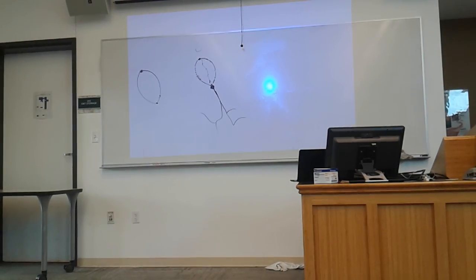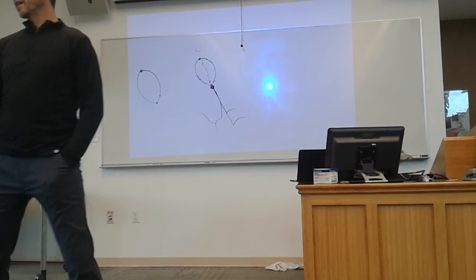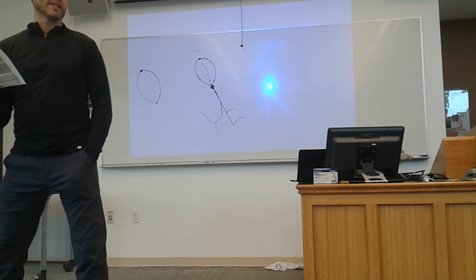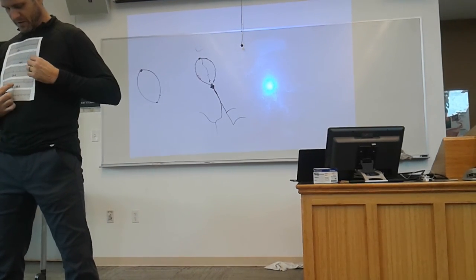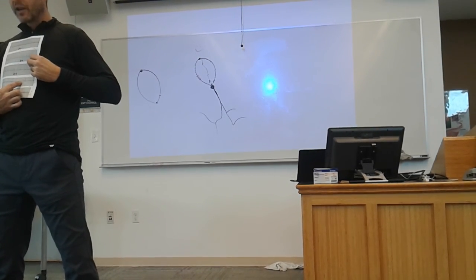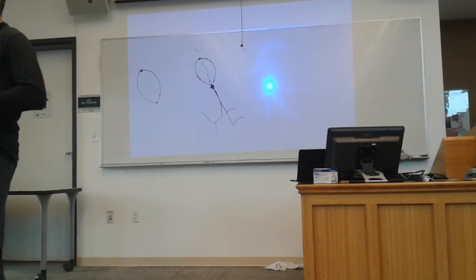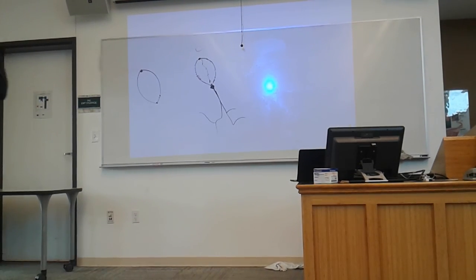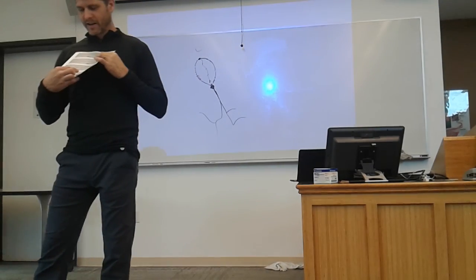You note that they all look the same, or at least that there's 2 of them in each complex that look exactly the same, right? These two, one following QRS morphology, and all of them look the same. You'll note, though, that the one right before it, which is where the T wave is, would look the same, except why? The T wave. It's got T wave activity that has to be plugged into it as well, right?